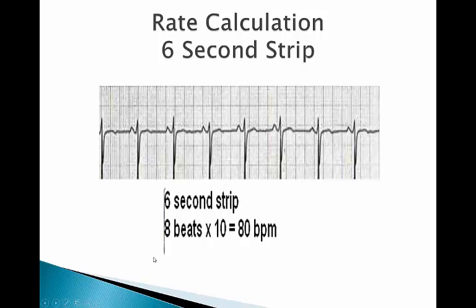And if you look at this, you see you've got a P wave in front of every QRS. You've got a nice narrow QRS, so if you measured that, it would probably fall in the normal limits. And then you have a nice T wave after every one. So this is normal sinus rhythm, but we'll get to that in a minute.